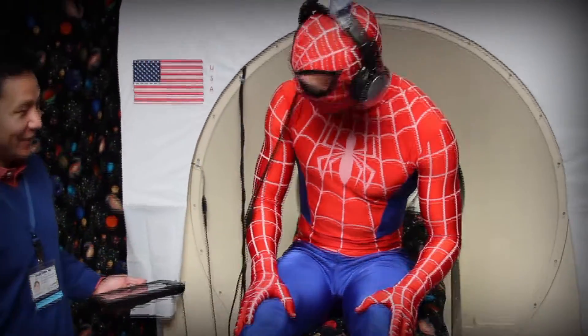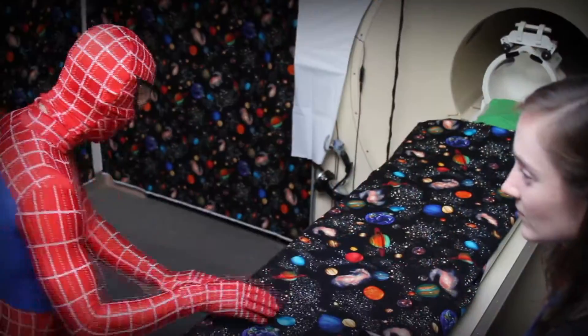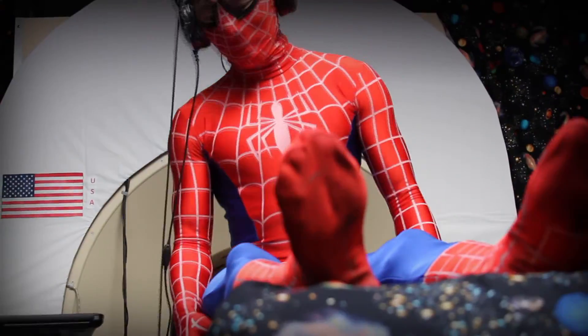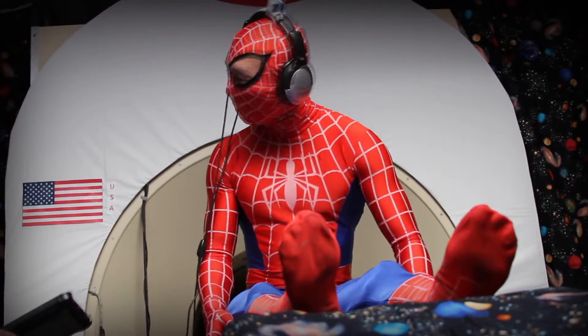We will show you how to make the spaceship move and you can even control it if you want to. Before you start your journey into space, you will climb onto the bed of the spaceship. You will get to see what it feels like when the bed moves. Spider-Man really likes this part.